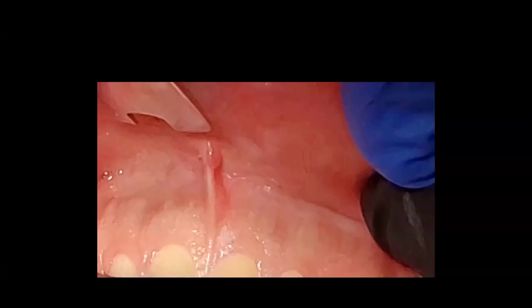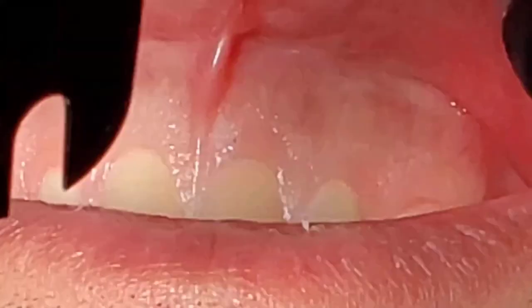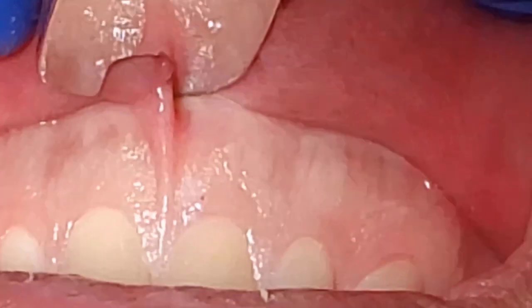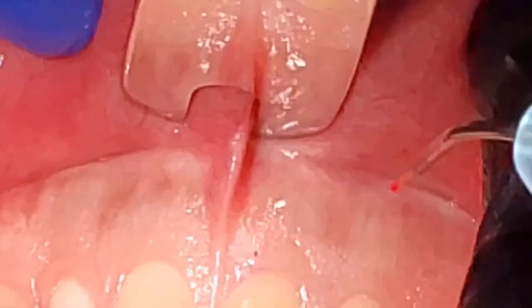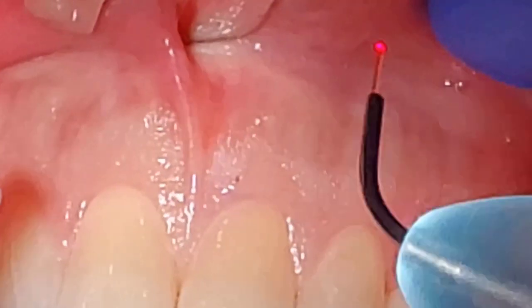This is a long video, but I want to take you through part of it so you could see it. So we're going to do a maxillary frenectomy here with the Gemini dual wavelength. This little tool here, this retraction tool, is something called a groove director that'll keep everything out of the way. We've raised the energy from the preset from 1.3 to 1.5 watts because of the lack of pigmented tissue here. This gentleman has just finished Invisalign, and we're going to do the frenectomy.